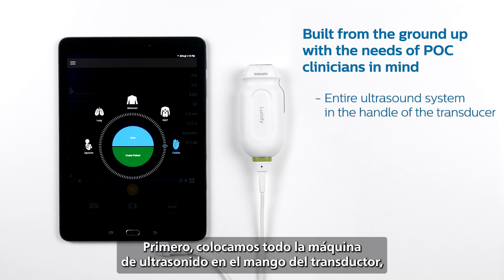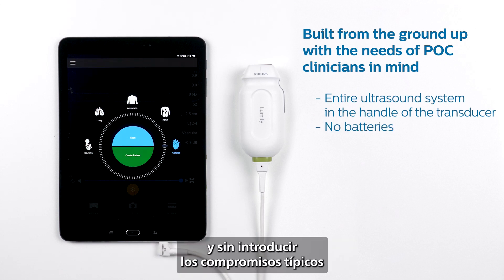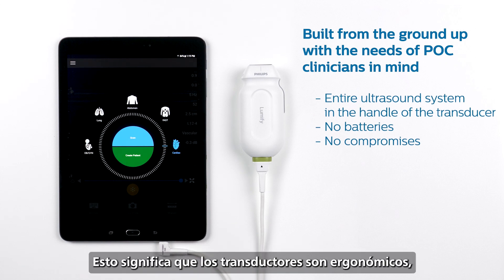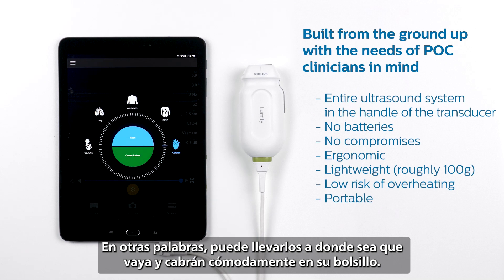First, we put the entire ultrasound machine in the handle of the transducer, and we were able to do this without loading up the transducer with batteries and without introducing the typical compromises that are common in other handheld systems today. This means the transducers are ergonomic, lightweight — around 100 grams — and they are at low risk of overheating. In other words, you can take them wherever you go and they'll fit comfortably in your pocket.